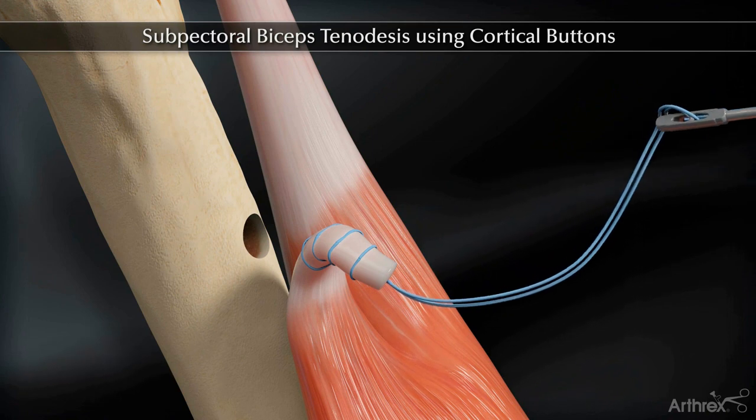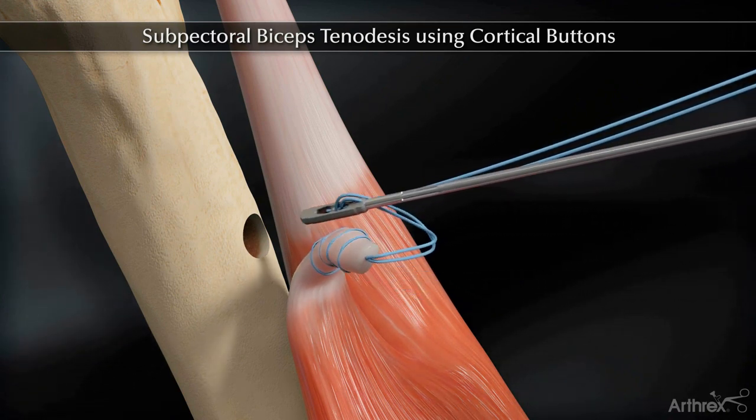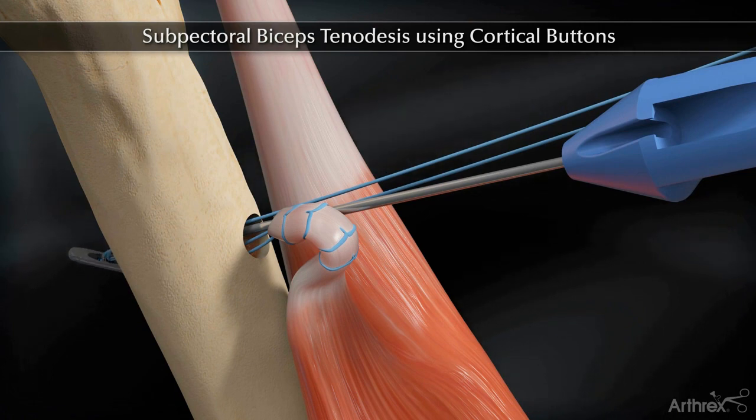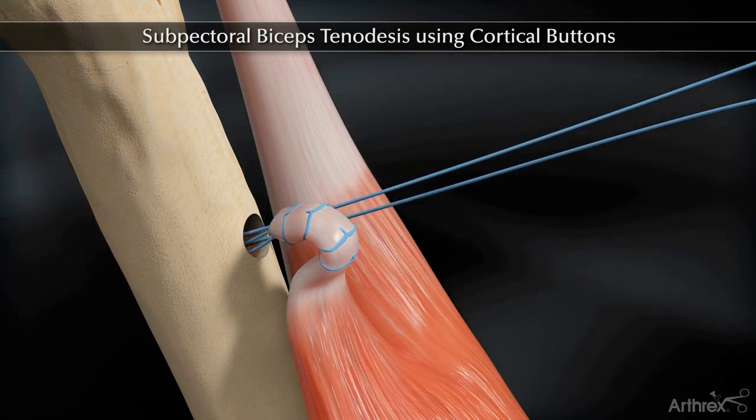Load the button onto the inserter and insert the biceps button through the far cortex. Flip the button and pull the suture limbs to dock the tendon into the tunnel.